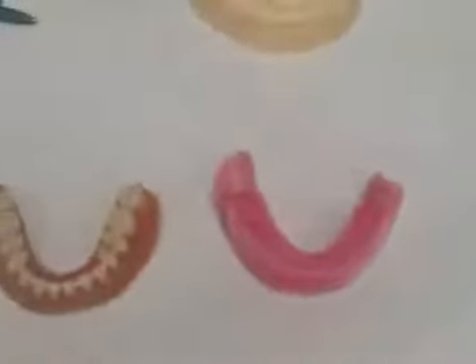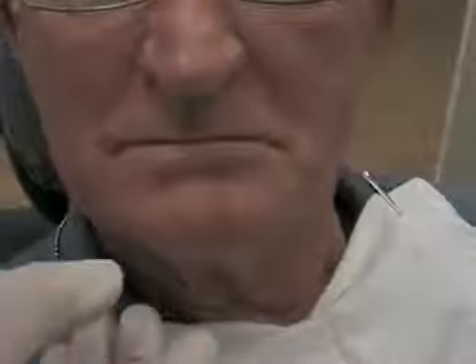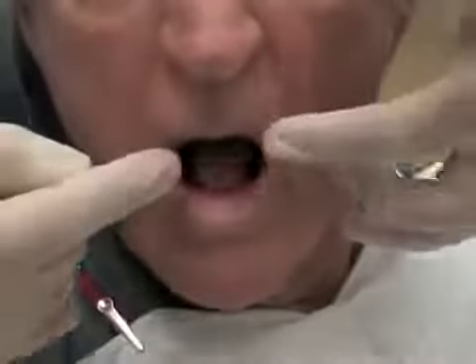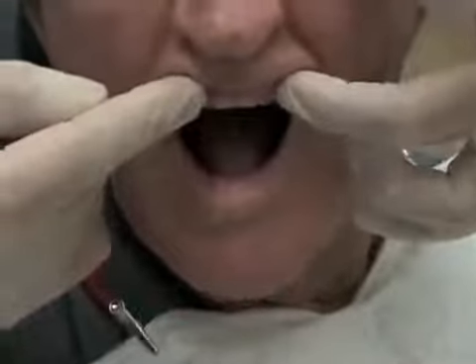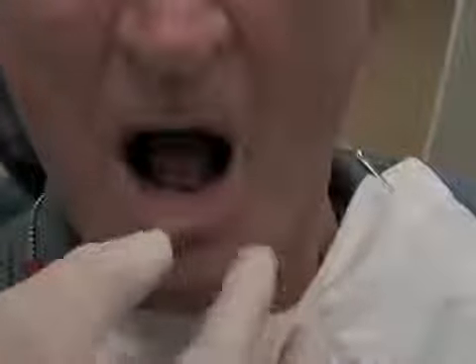Because the patient's denture won't fit on the master cast, we'll use a record base and wax rim to determine the occlusal vertical dimension. Before we begin to adjust the rims and determine our vertical dimension, we'll take the patient's existing dentures and look at what type of support and what height the patient has with those dentures. You should be able to see the denture teeth just at the edge of the lip. This patient doesn't have sufficient support or length of the teeth. So we'll make those determinations before we begin using the wax rims.